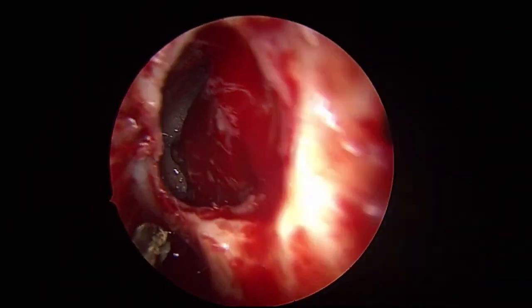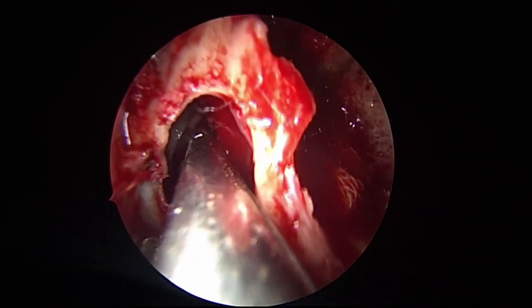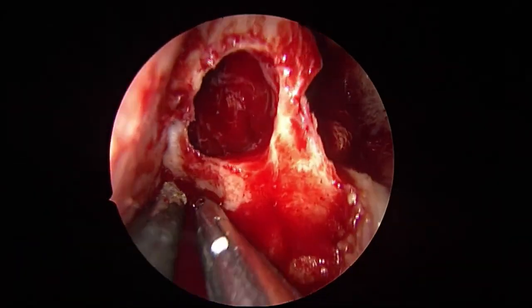See the maxillary sinus from inside? Clearly seen. See this bulge of this wall. I told you this will complicate our life, if you remember.